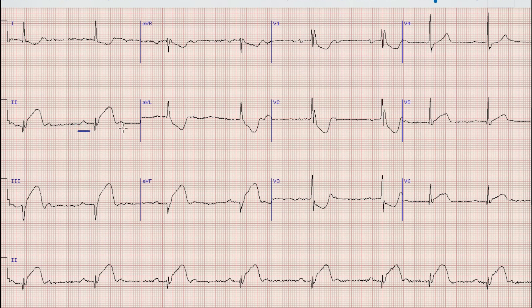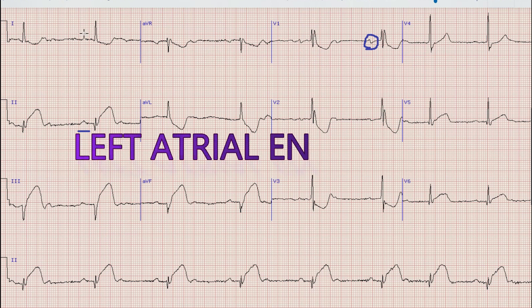The duration of the P-wave is prolonged — it is about 2.5 small squares — while in lead V1 the P-wave is biphasic with a deep and wide negative terminal end. This means that there is left atrial enlargement.